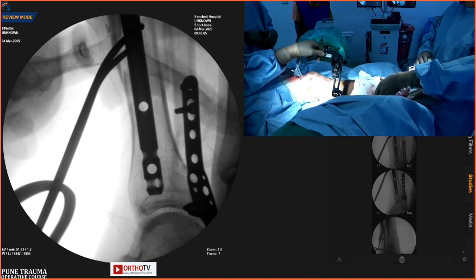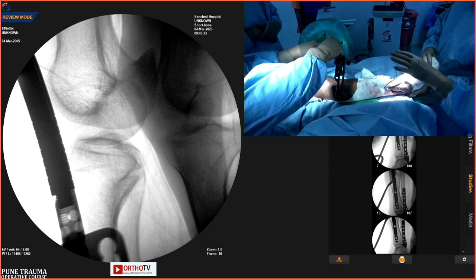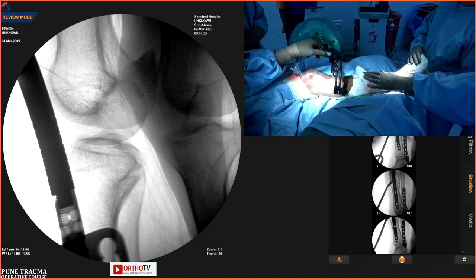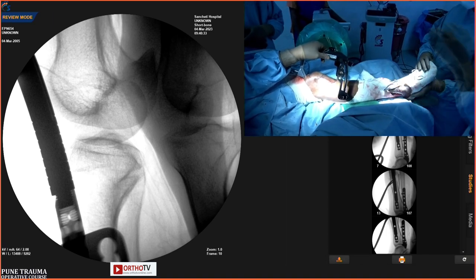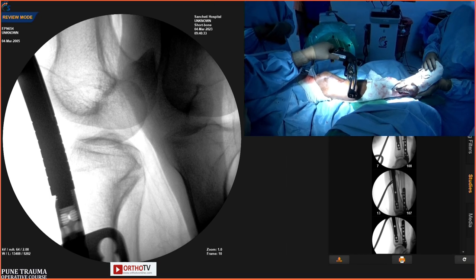Sir, if you remove the screws in the fibula, I think fibular reduction will further improve when you are locking. That is not an issue. Here, the issue is the suprapatellar. Sir, we will. In a distal tibial fracture. No, right now you remove the screws. It will align itself. Proximal screws at least.